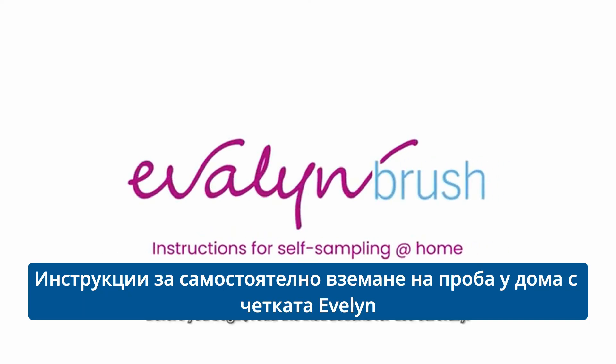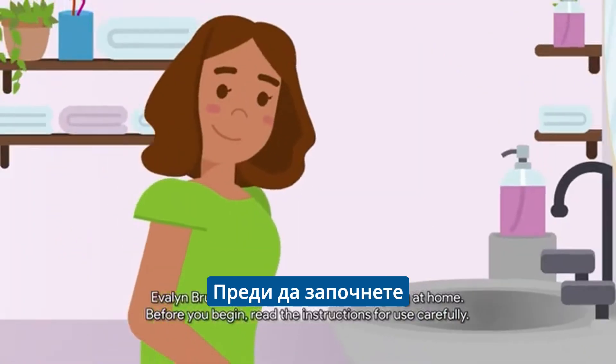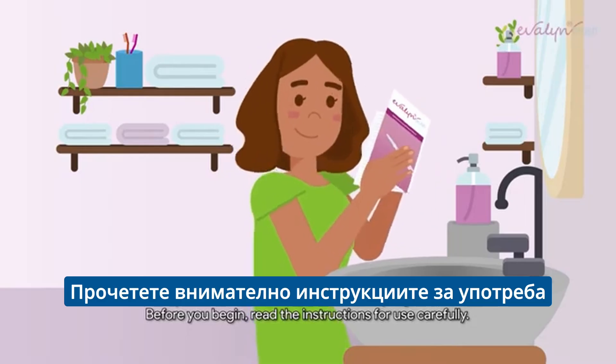Evalyn Brush. Instructions for self-sampling at home. Before you begin, read the instructions for use carefully.